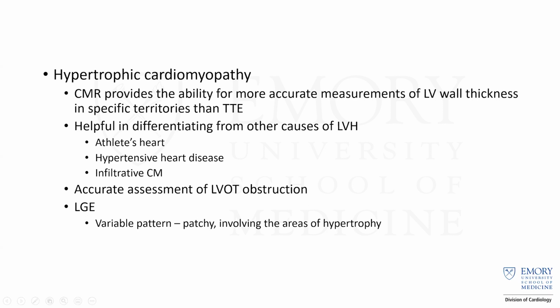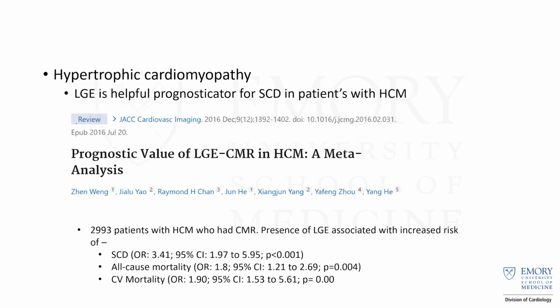On a hypertrophic cardiomyopathy patient, you'll see that there's some gadolinium enhancement, there's some fibrosis there, which will light up on the gadolinium images to help differentiate what you're dealing with and show you exactly where there is some scar there.